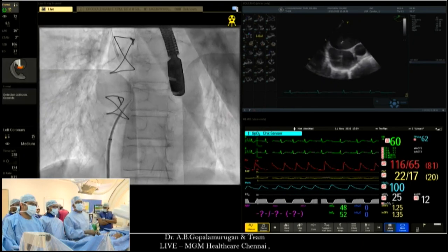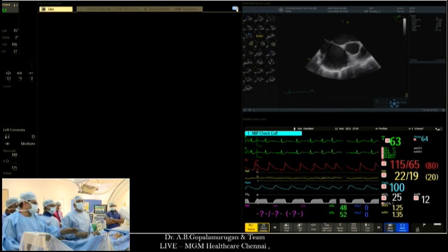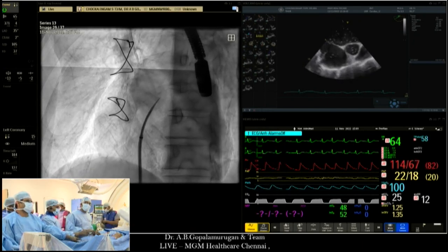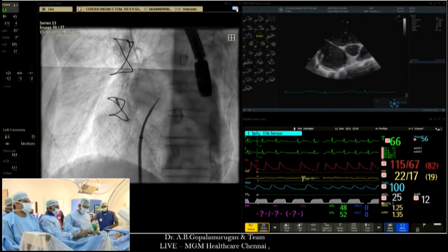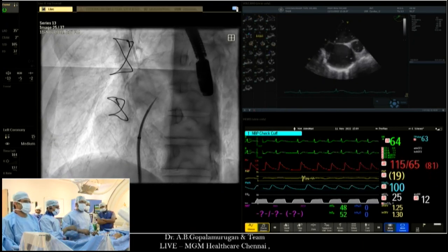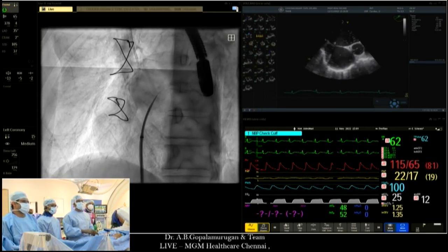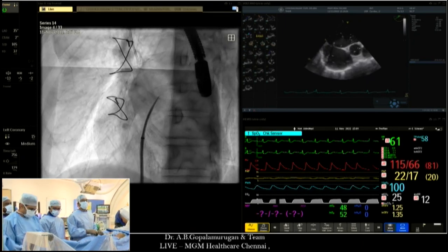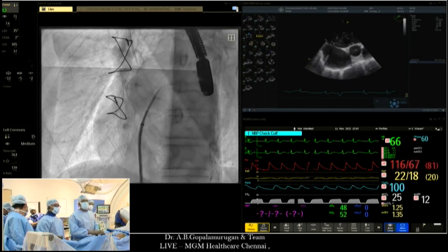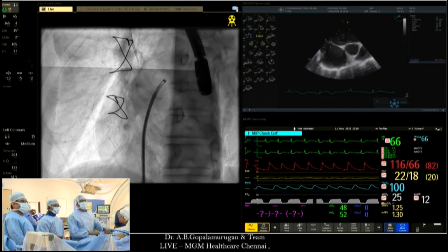Septal puncture is the most crucial part for TMVR. And for TMVR, it is usually inferior and posterior, so that you can have a good alignment to take your device across the mitral valve. I'll tell you, this is the fourth time we have been trying to get a transeptal, and there you go. We just now managed to get it in the right position where we think we should be. It's a fairly tough transeptal.